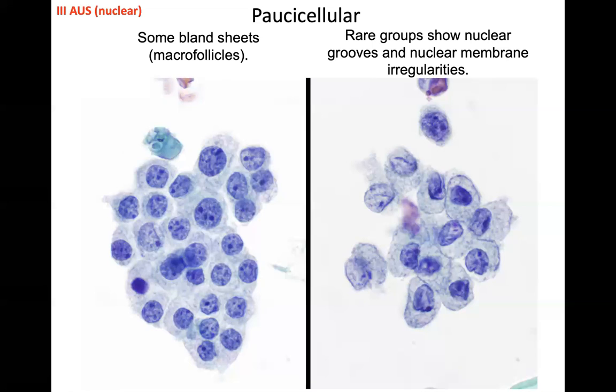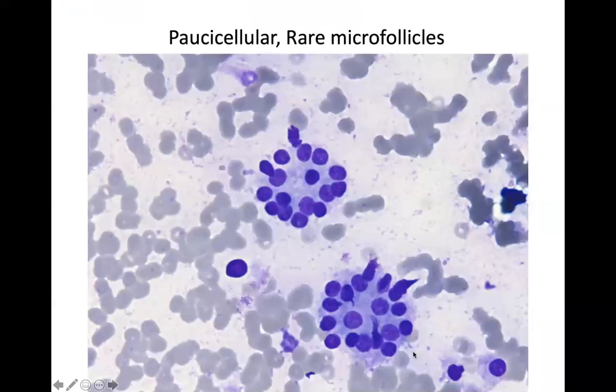So as we'll talk about later, this is atypia of undetermined significance, which is predominantly small groups with nuclear atypia, but not flat out carcinoma. These end up having a higher risk of being papillary carcinoma than those that are just FLUS architectural atypia in terms of microfollicles. Those tend to end up being follicular adenomas or follicular neoplasms, okay? And I'll give you those data later. But so for those of you who said AUS, correct. In this institution, we do differentiate AUS from FLUS.